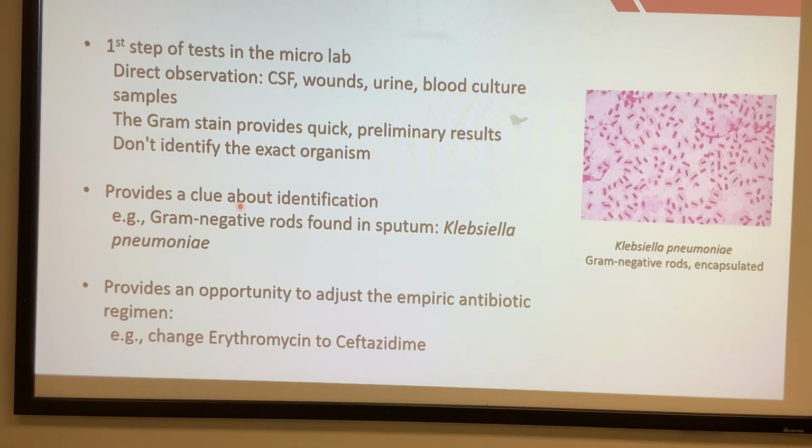So it must be solid. Solid fecal. Solid or liquid, no matter what, if it's a fecal sample, we don't do gram stain. We do handle fecal samples. A lot of the time, fecal samples are sent down for molecular testing and streaking for culture, not for gram stain. And a lot of the time, you do examine the sample for parasitic infection, eggs and the parasites.